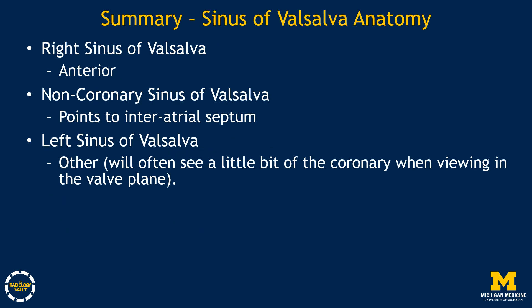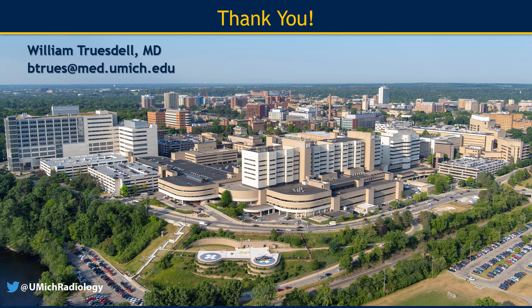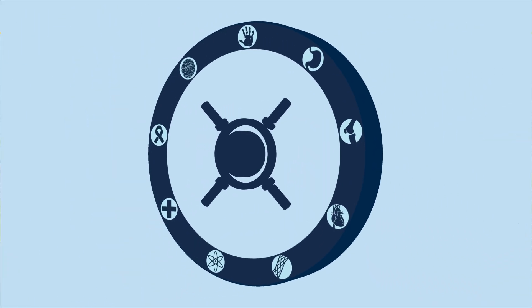Finally, reviewing sinus of Valsalva anatomy: there are typically three sinuses labeled right, left, and non-coronary based on the coronary artery that arises from them. Key landmarks are that the right sinus points anteriorly, the non-coronary sinus points to the interatrial septum, and the remaining sinus is the left. The key is finding your anatomic landmarks and identifying anterior versus posterior and which chambers are the atria. If you can remember the anatomy discussed in this video, you will be well on your way to reviewing cardiac CTs. Thank you.